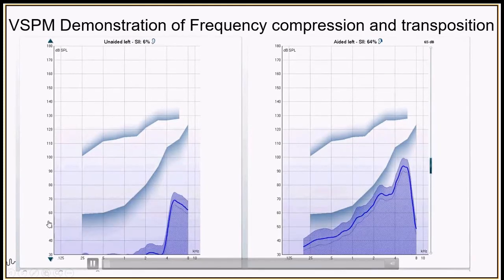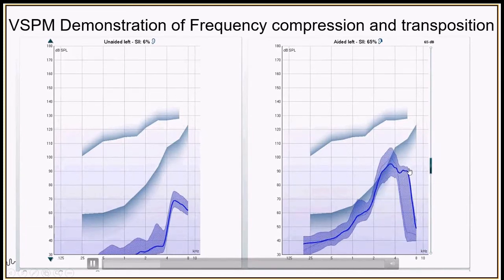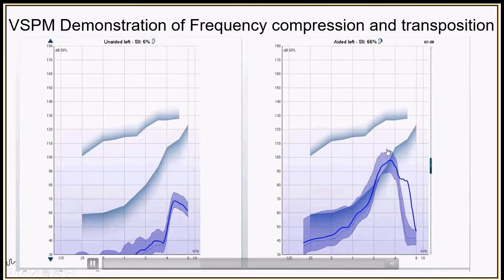So first of all, we start up, and here we have the amplified SS signal, and here's its signal shape without any amplification, and the feature is off. So automatically there was no audibility there. Now we've turned it on, and we can see the images that we had before, and we can see very quickly that we're giving stimulation now in the patient's dynamic range.